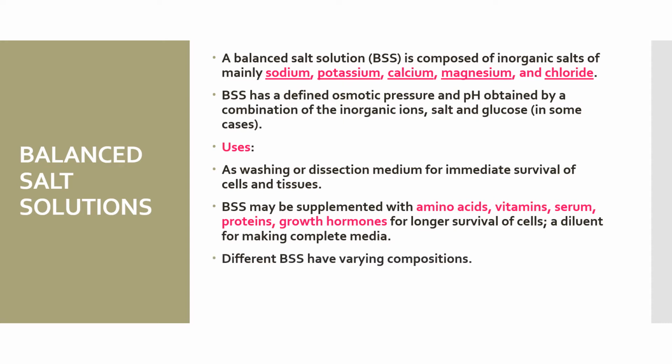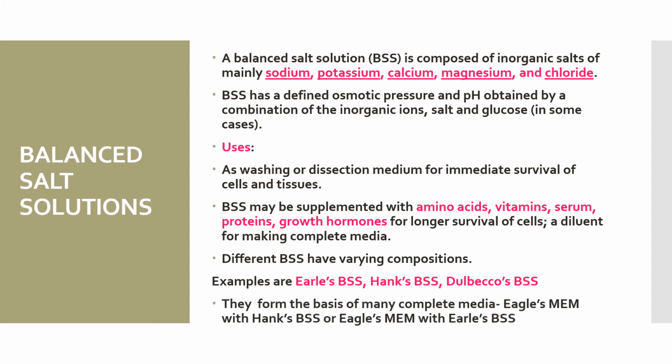There are different balanced salt solutions with varying compositions, and examples are Earle's balanced salt solution, Hanks' balanced salt solution, Dulbecco's balanced salt solution. They form the basis of many complete media, like the Eagle's minimum essential medium with Hanks' balanced salt solution, or the Eagle's minimum essential medium with Earle's balanced salt solution.